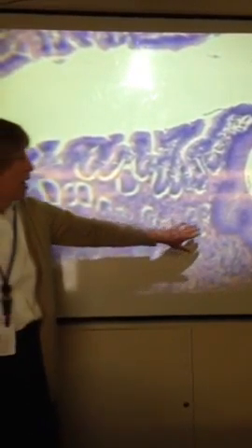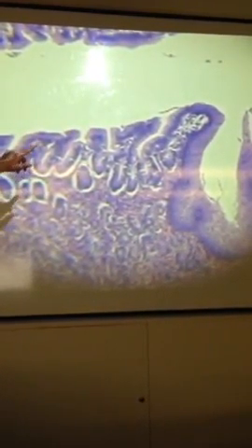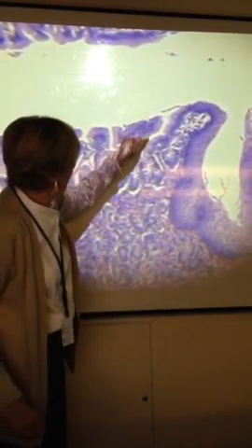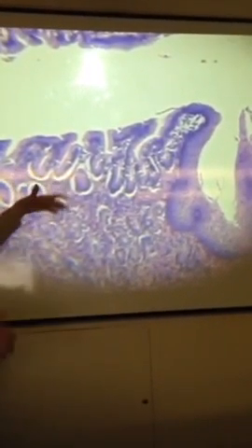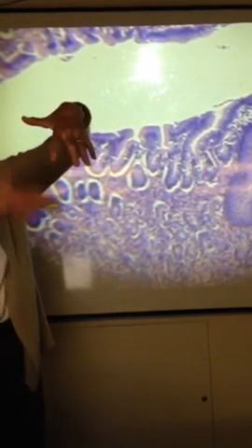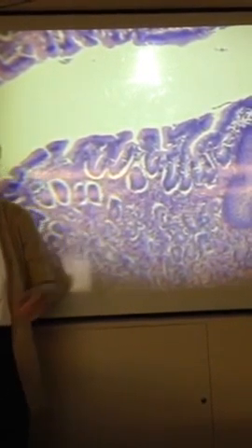But stratified squamous, right? And then we're going to come over, and we're going to see simple columnar with a gastric pit moving into gastric glands. Gastric pit, gastric pit, gastric pit. And then somebody said, well, why don't you get that nice longitudinal cut? Well, this is a convoluted stomach. It might be on a rugae or something. So rather than nice longitudinal cuts of those gastric glands, you get a lot of oblique or cross sections, and then they just sort of look other than a nice longitudinal section.